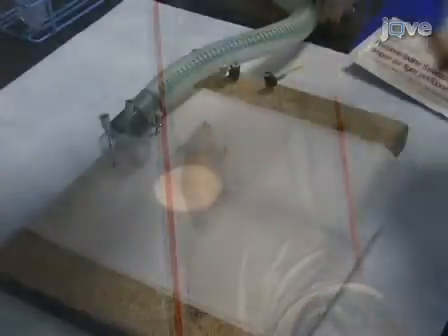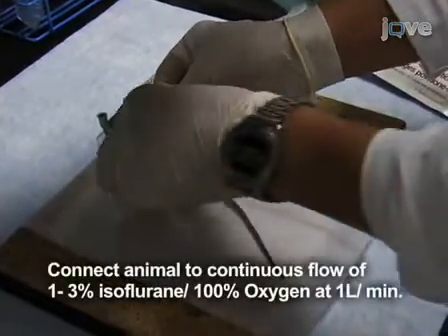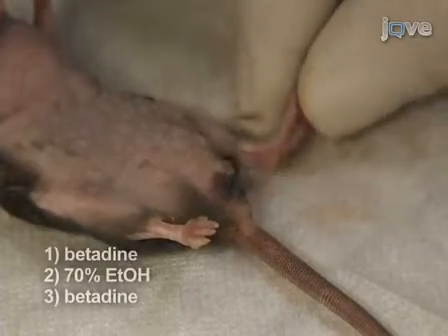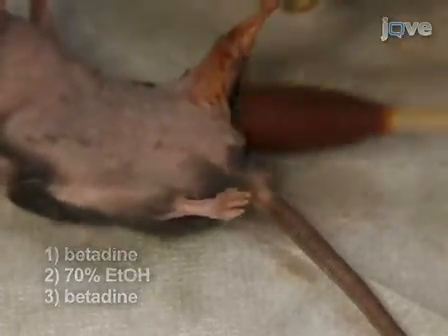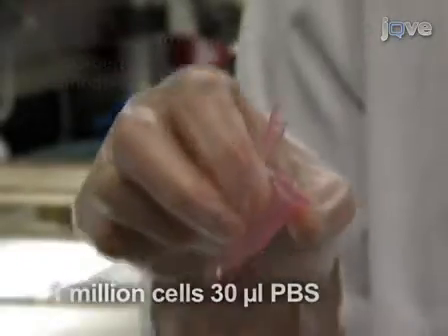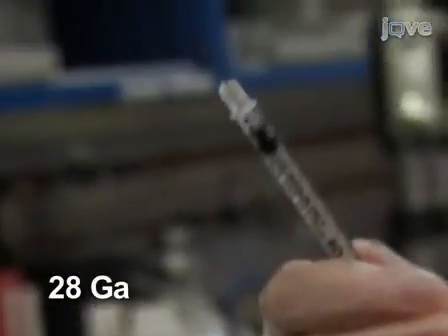Then place the animal in the supine position onto the operating table and connect it to a continuous flow of 1 to 3% isoflurane in 100% oxygen at a flow rate of 1 liter per minute. Wipe the skin of the hind limb with 3 alternating betadine and alcohol scrubs. Once the skin is cleaned, obtain 1 million murine embryonic stem cell-derived endothelial cells in 30 microliters of phosphate buffered saline, PBS. Load these cells into a 28-gauge needle.